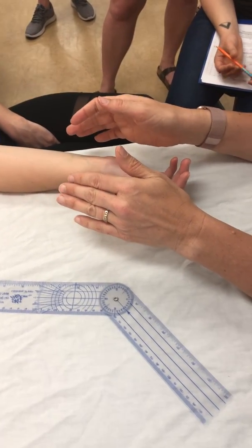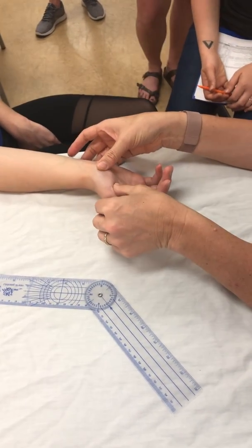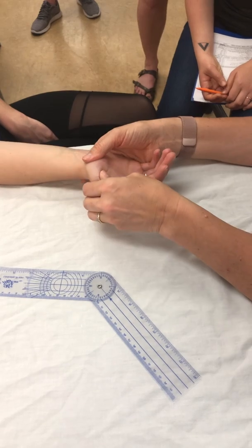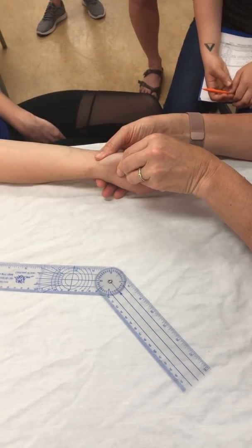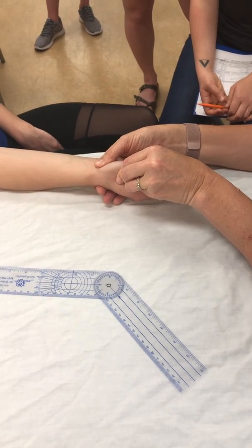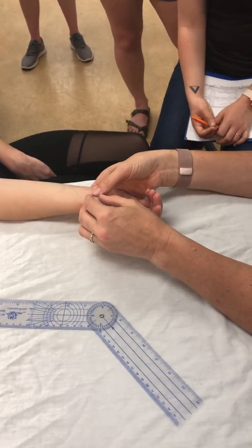Everyone good? Because I kind of screwed that up. All right. So flexion and extension are going to be measured the same way. For passive range of motion, I can still take it out and feel the end feel. I can bring it across and feel the end feel. Okay? So those are our major CMC motions.